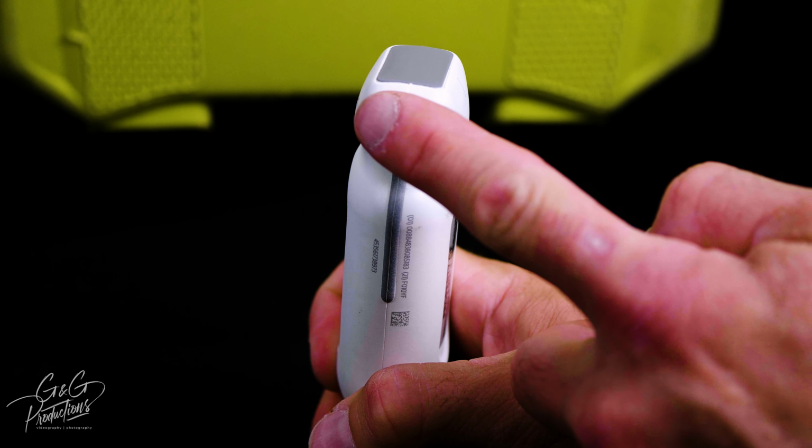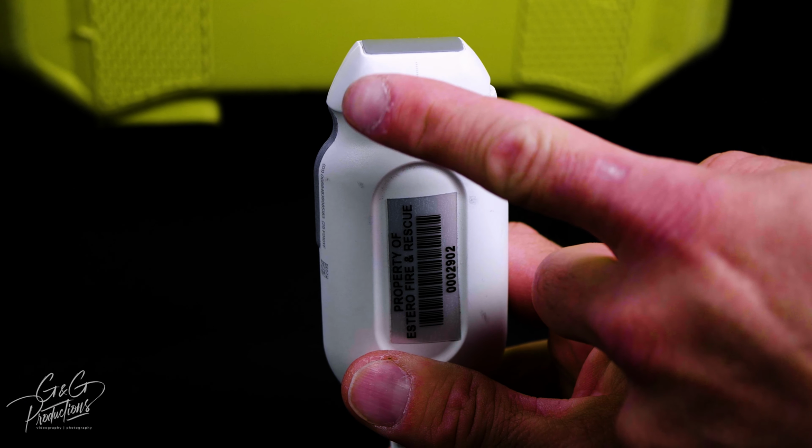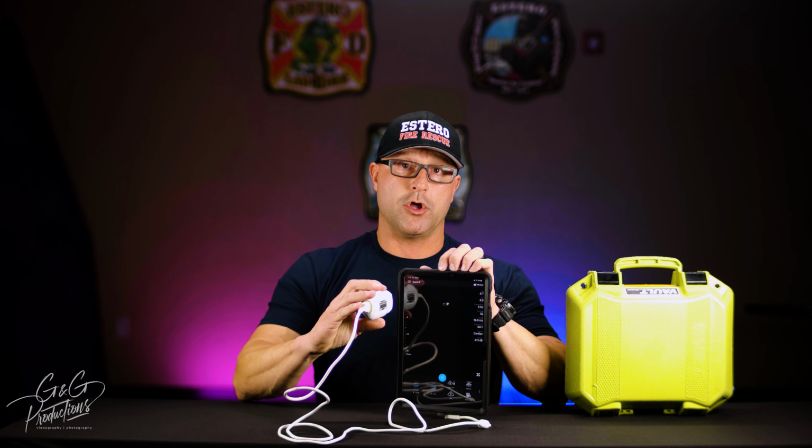This is the short axis right here, and this is going to be your long axis here. We need to know what the short and long axis are because of our exams. One of our exams is called the Parasternal long axis exam, and we put this transducer along the long axis, or it's also known as the PLAX exam.